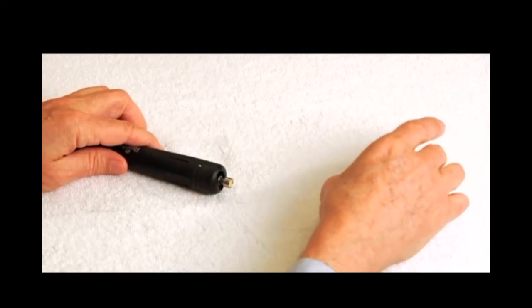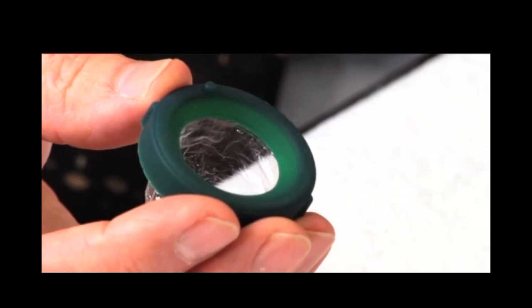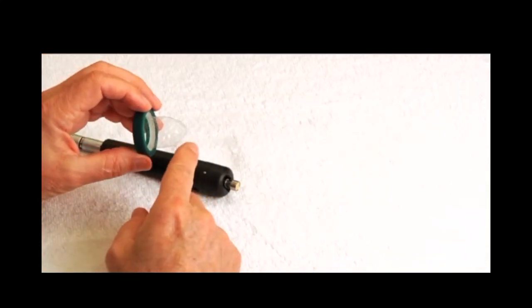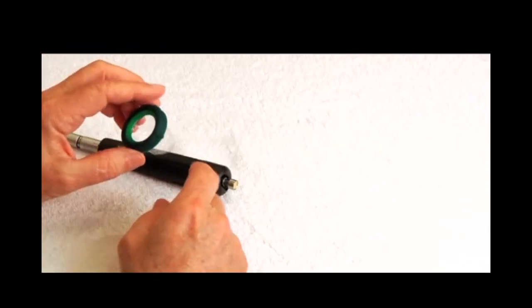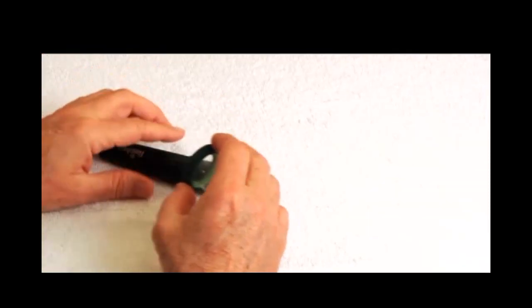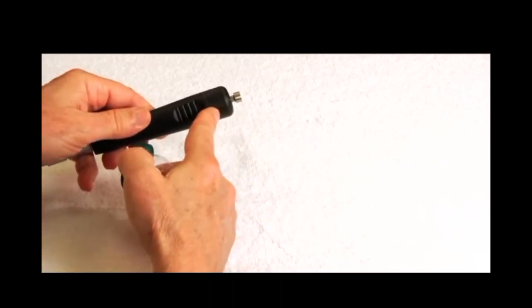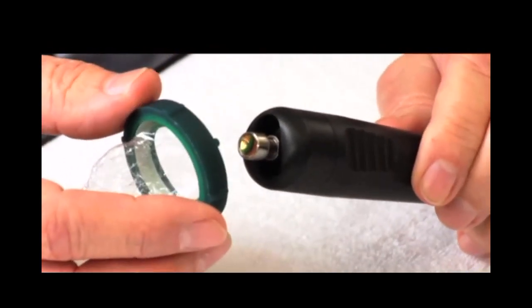I want to show another device. This is an FDA approved device called the ClearScan cover. Basically, it's a collar and a proprietary material here that is acoustically invisible. We're going to fill this full of water and we're going to push this on quickly onto the front of this probe. Again, this cover has to be in place or this ClearScan will not secure.